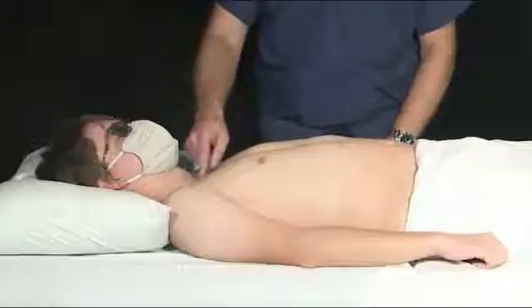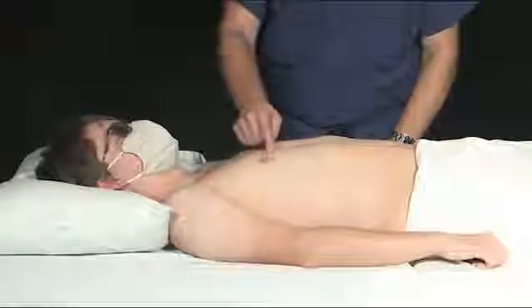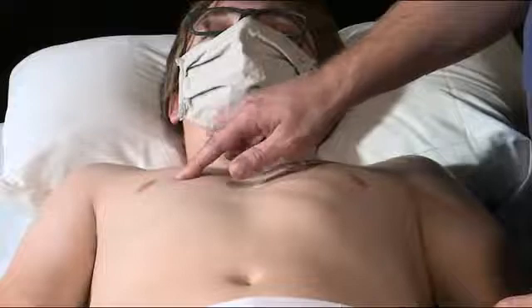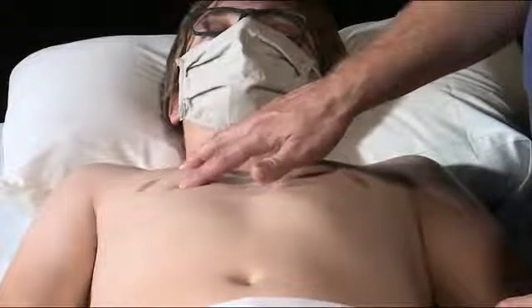The patient needs to be lying supine in order for us to detect a pneumothorax. We are going to image along the anterior chest. Specifically, we are going to draw an imaginary line along the mid-clavicular line. We're going to image just around the nipple, between the third and the fifth intercostal space.